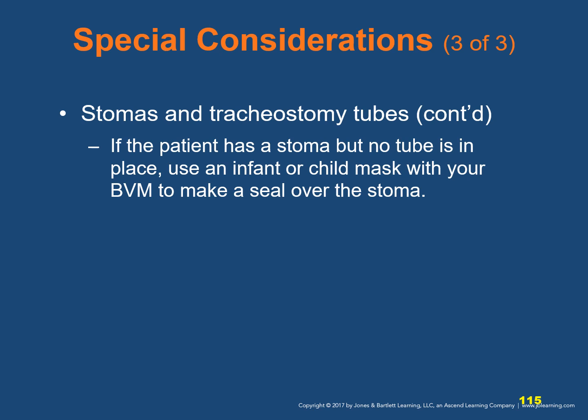Seal the patient's mouth and nose with one hand to prevent a leak of air through the upper airway when you ventilate through the stoma, and release the seal of the patient's mouth and nose for exhalation. This allows the air to escape through the upper airway while maintaining a seal over the stoma. If you cannot ventilate a patient with a stoma, try suctioning the stoma and the mouth with a French or soft tip catheter. Seal the stoma while giving mouth-to-mouth ventilation.